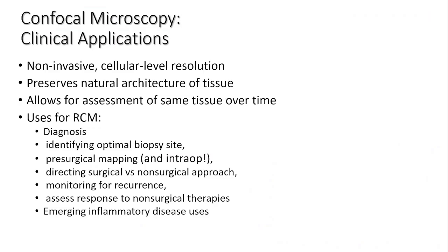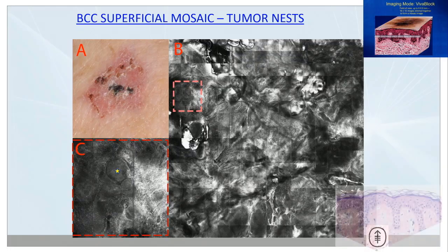And like Dr. Tierney was showing, there's so many applications that you could imagine for real-time imaging, especially of the skin, which obviously is our largest organ. Dermatologists love to say that. But there's so many useful things to do. We can identify biopsy sites, we can map out lesions, we can direct the management using surgical or non-surgical tools.